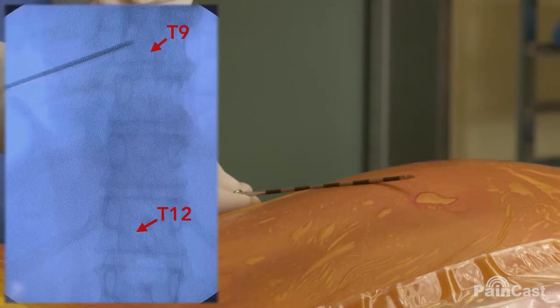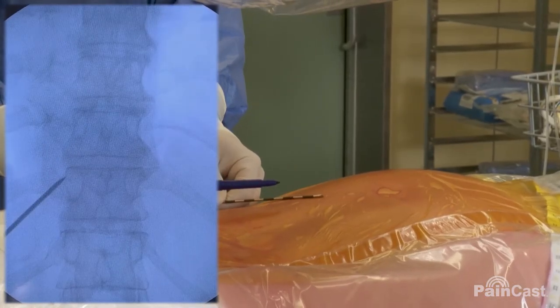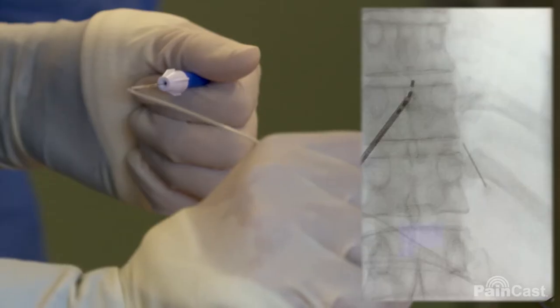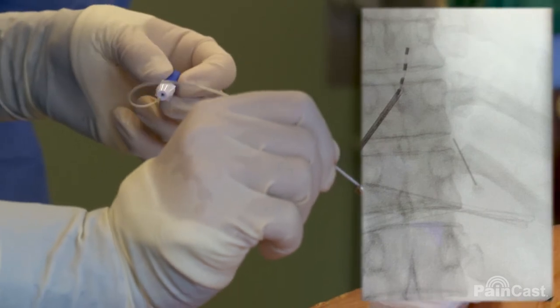On fluoroscopy, we identify the T9 vertebra. We lower one level and mark the point where the epidural needle will be placed. We then advance and guide the lead gently, pushing it through the ligament of the neuroforamen.